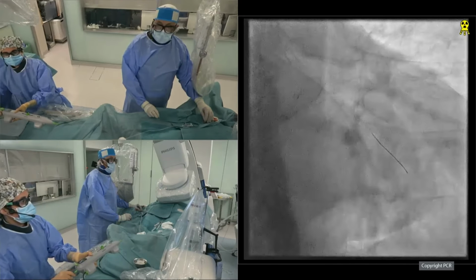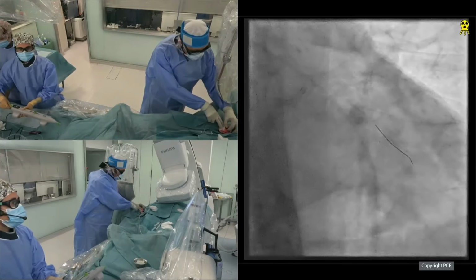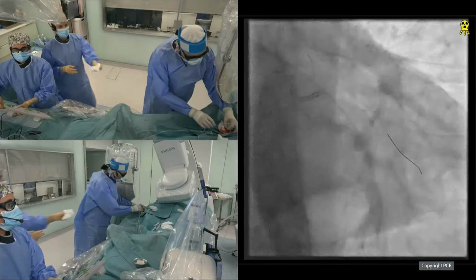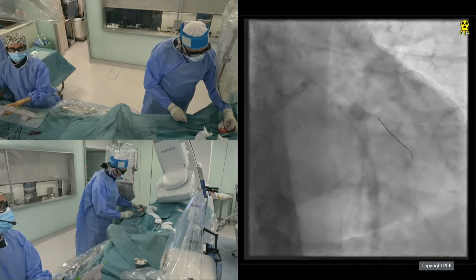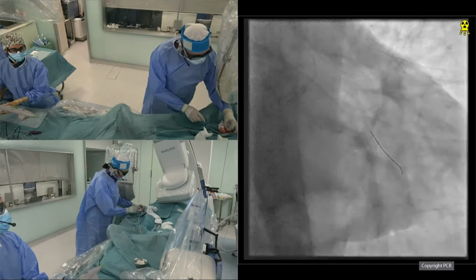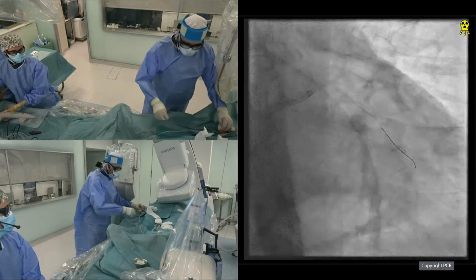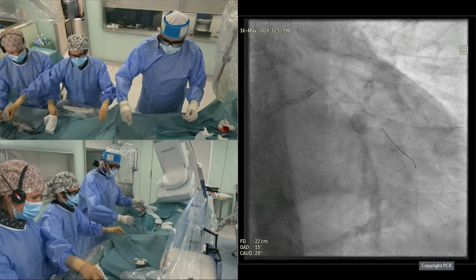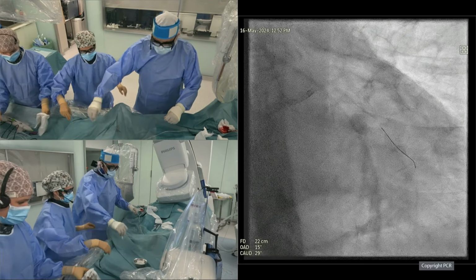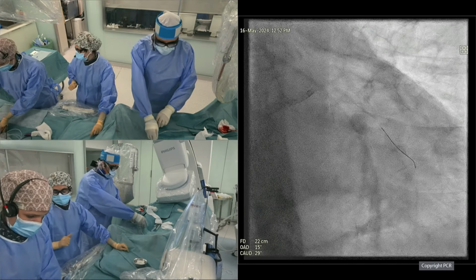Let me take the opportunity to get some questions from the chat box. Ewald, there are some technical questions here. What wire are you using, and did you bring it down with a microcatheter, or did you wire it directly? And can you explain your criteria for going from low speed to high speed? I think the first question is interesting. You already told us that you cross with the Sion and then exchange over the microcatheter. Perhaps you can tell us more about this Viper wire. Is it hydrophilic? Is it a good performing wire?